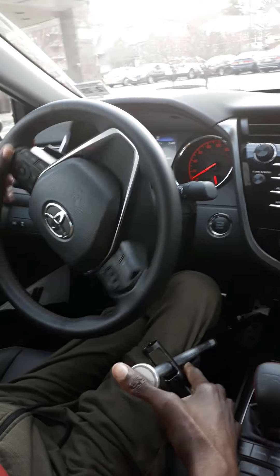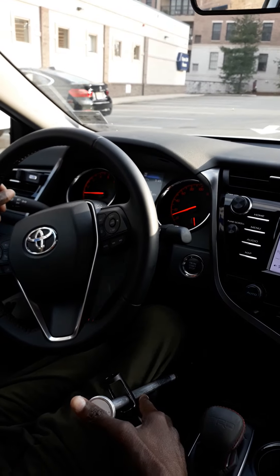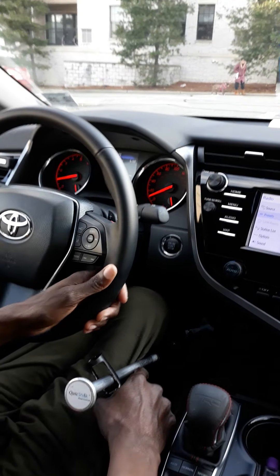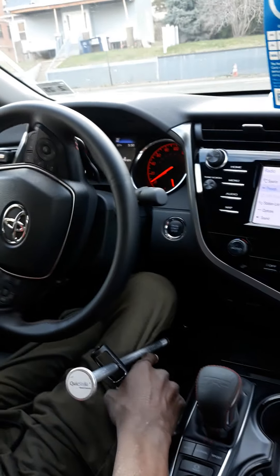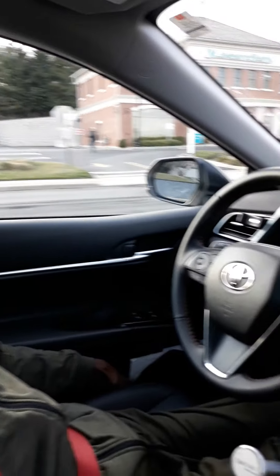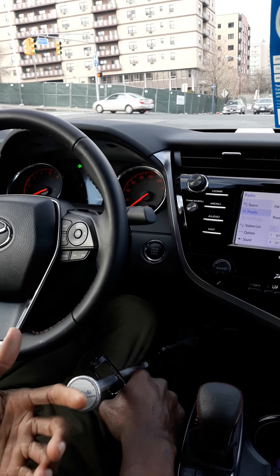Most people would think while driving with a portable hand control that it's not the same as driving regular. It's the same concept. The only thing is that you got to adjust to using the brake and the gas. For me personally, I feel like the only hard part — which wasn't really hard — was adjusting to braking. Because the brake reacts a lot quicker than it does when you're using your foot to brake. So you had to get used to that feeling and find your sweet spot of how much pressure you need to apply while braking. But other than that, it's the same way you drive — the same way you signal and steer. Everything is the same concept.